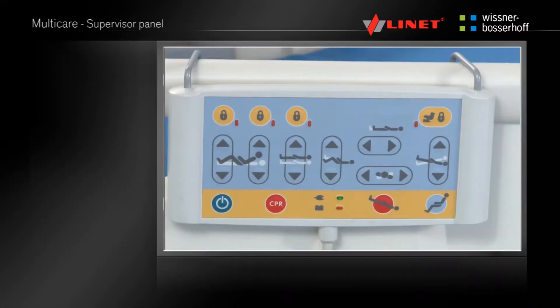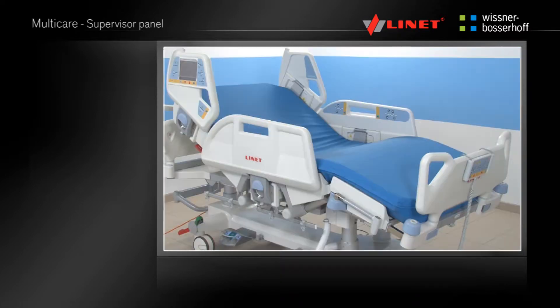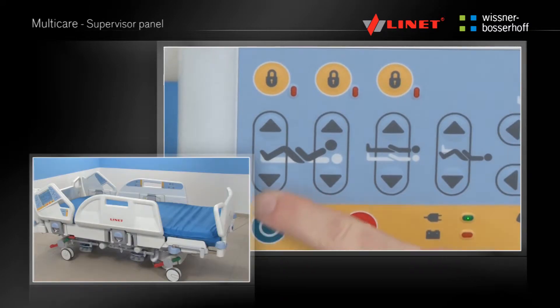The supervisor panel can be hooked along the side of the bed, the side rails or over the footboard if required. Before using any function, press the activation Go button. The safety Go button remains active for 3 minutes.